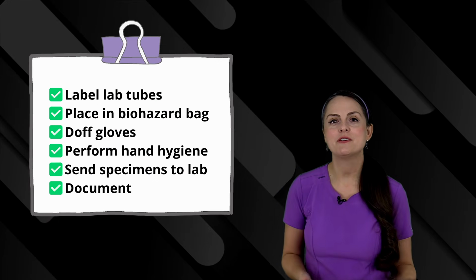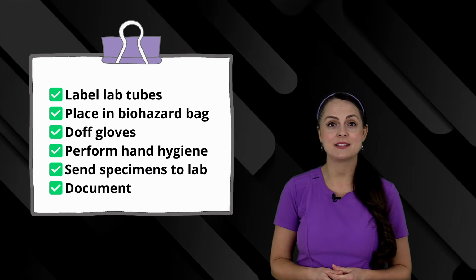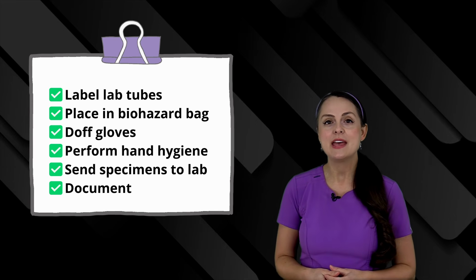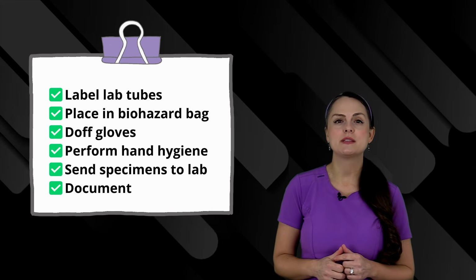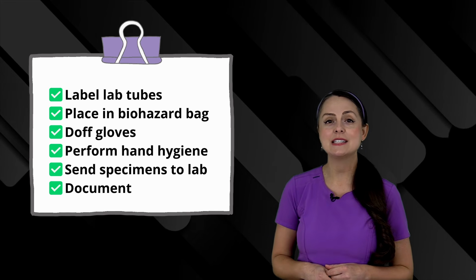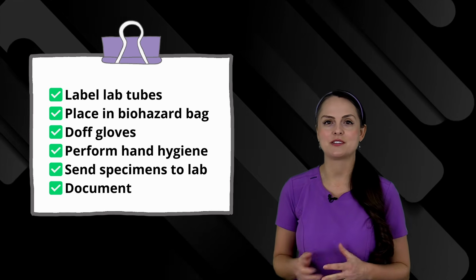Once you're done with that, you want to make sure that you take those lab tubes and you label them at the bedside in the patient's presence. Then take those lab tubes, put them in a biohazard bag, doff your gloves, perform hand hygiene, then send the specimens to the lab, and then document the procedure as required.